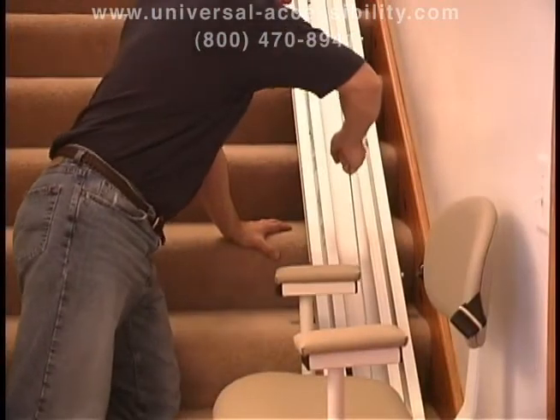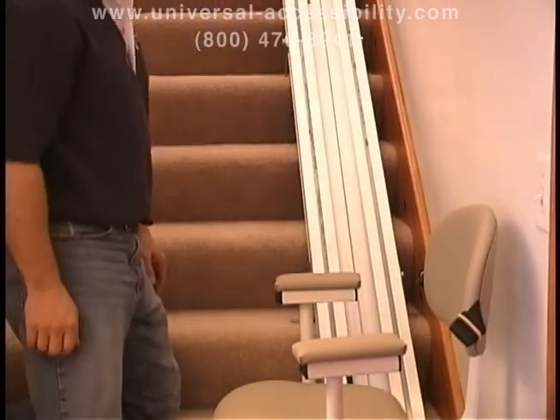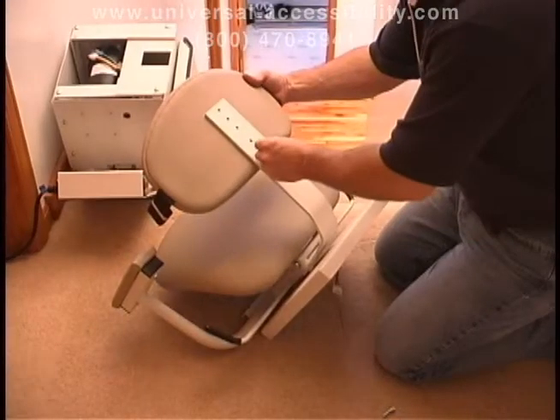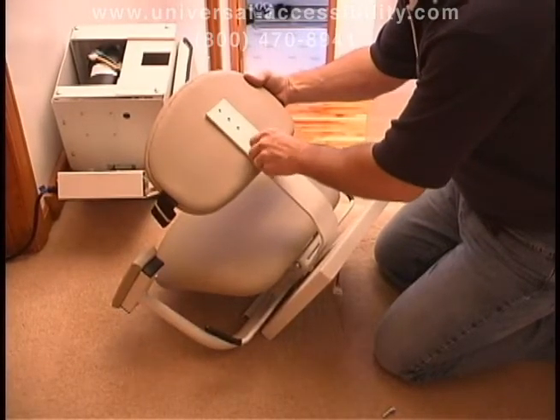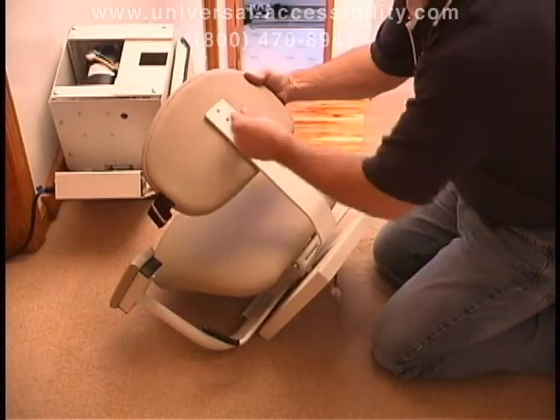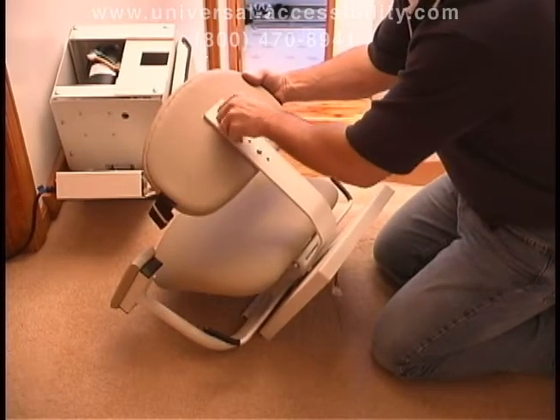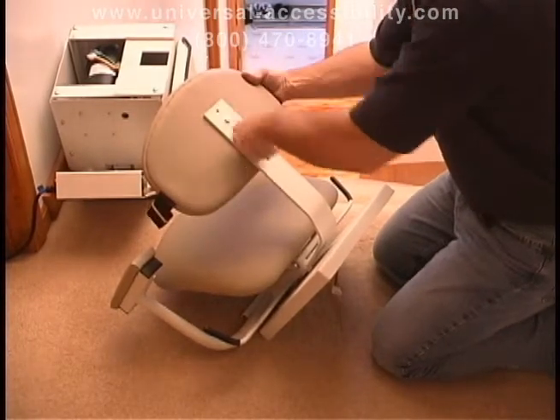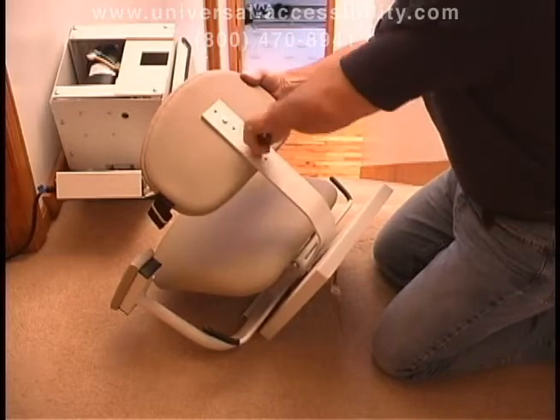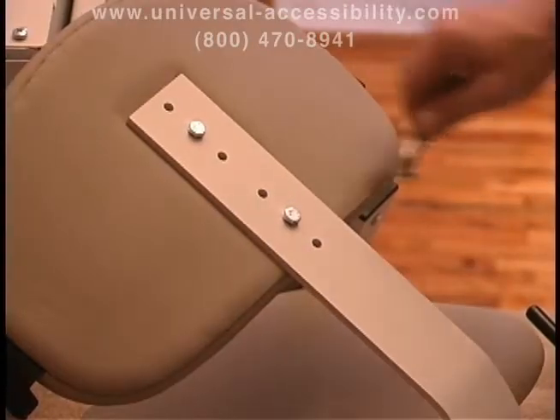Another way to reset the device is to pull up on the cable until you hear it click or you feel the cable tighten on its own. Install the seat before adjusting the upper limit cam. Remove the seat box and the two call controls from the box and set the call controls aside for now. Remove the screws from the backrest and attach the backrest to the preferred height position on the back bar and then retighten the screws.